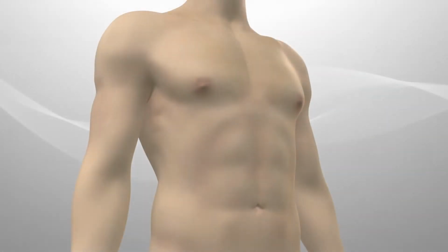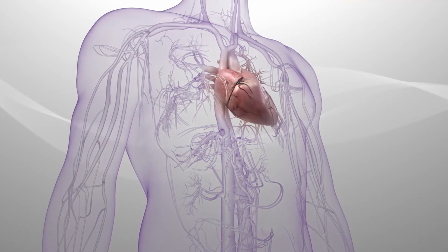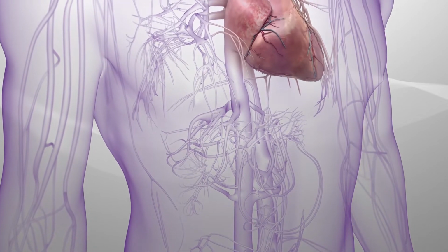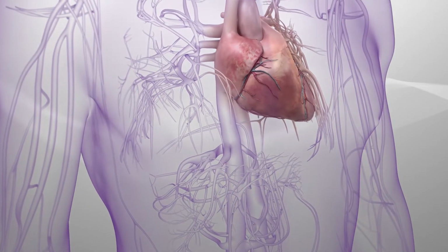Pulmonary thrombectomy requires safe passage of a catheter through the right heart into the pulmonary artery. Familiarity with relevant anatomy and technique can increase the likelihood of successful catheterization and reduce the chance of cardiac injury.